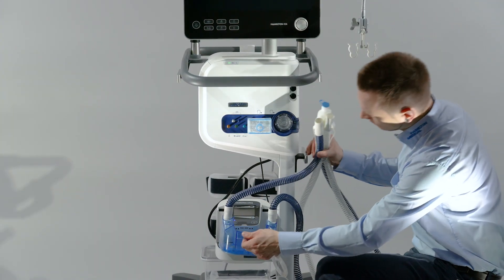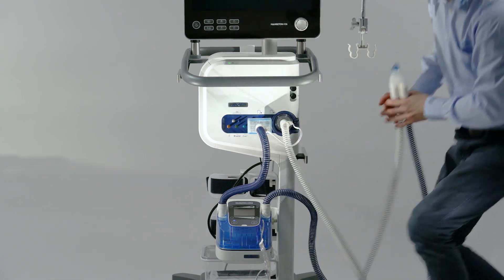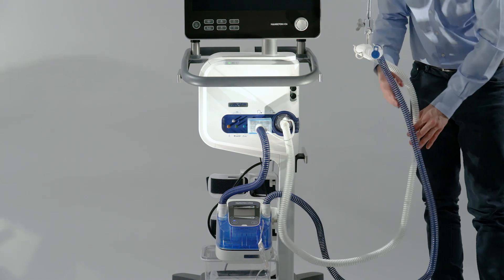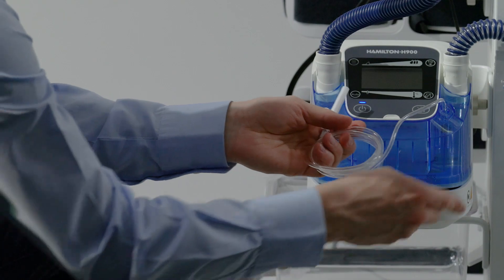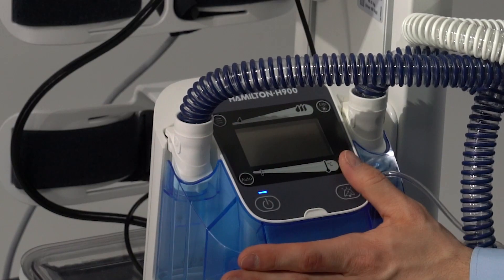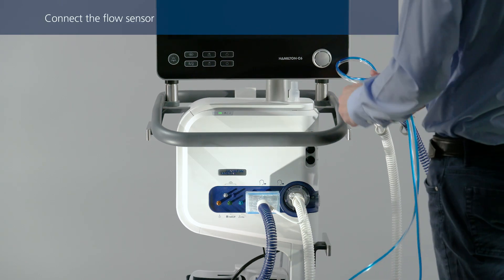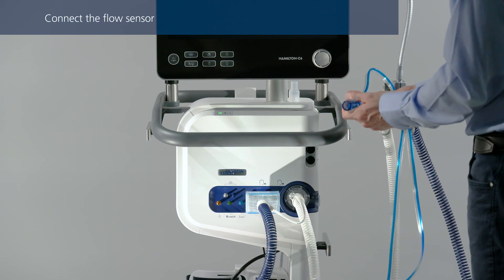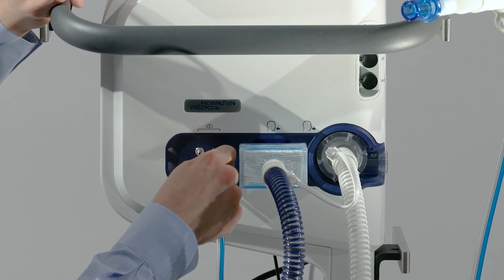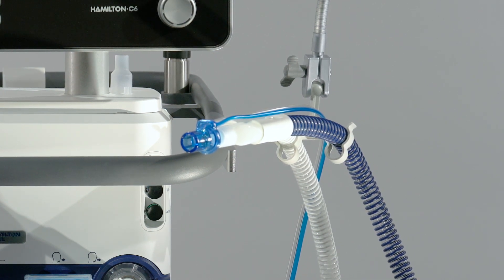First, insert the humidifier chamber. Connect the shorter blue tube to the inspiratory port on the ventilator. Then connect the expiratory tube to the expiratory valve. Insert the water feed line into the water bag or bottle. Make sure that all electrical contacts on the breathing circuit match the connecting element on the humidifier. Insert a flow sensor into the breathing circuit in front of the patient connection, that is, the Y piece. Attach the blue and clear tubes to the flow sensor connection ports on the ventilator.